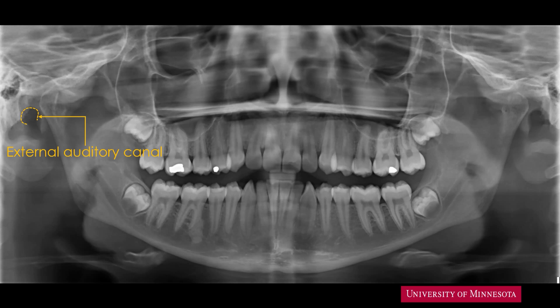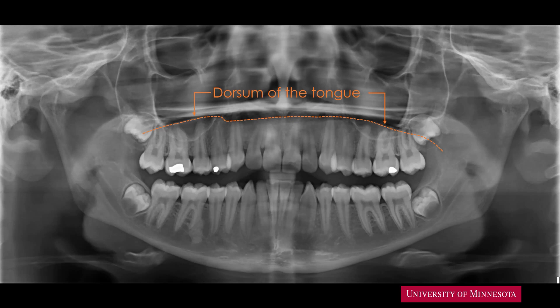Inferior to the hard palate is a line of contrast, with a radiolucent band between this line of contrast and the hard palate. The line of contrast is the dorsum of the tongue. Ideally, a panoramic radiograph is taken with the dorsum of the tongue in contact with the hard palate, so the dorsum of the tongue should not be visible. Frequently, patients are unable to hold the tongue on the roof of the mouth, and therefore the dorsum of the tongue may become visible.